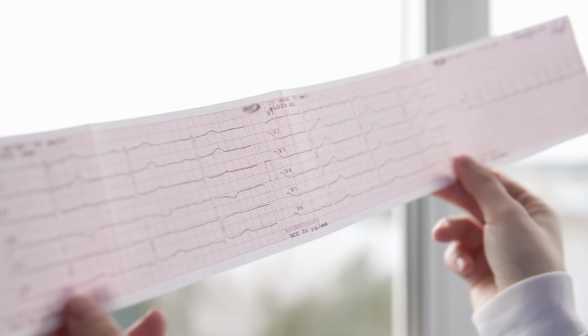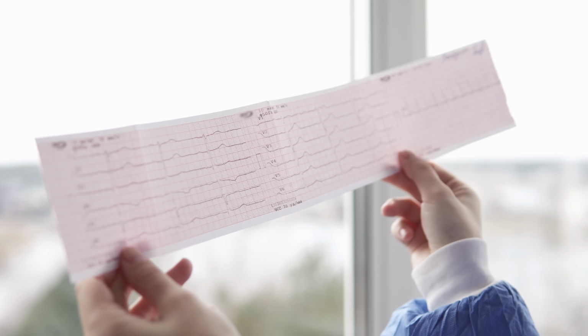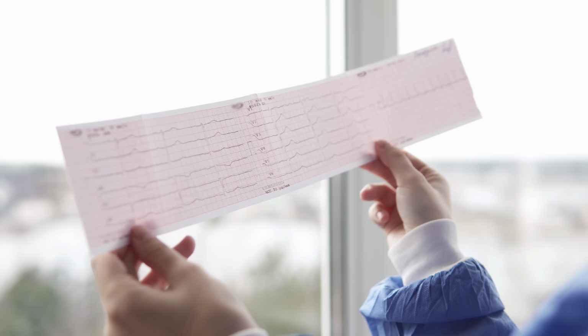Very tough. And I guess the main shortcoming of the EKG is that it's a picture. Just like taking a picture versus a movie, a lot can happen between the pictures that is relevant. Absolutely. And it's a 5-second picture at that period of time.